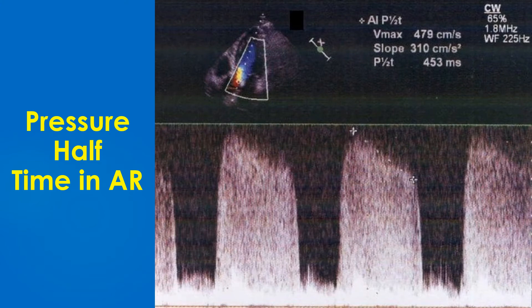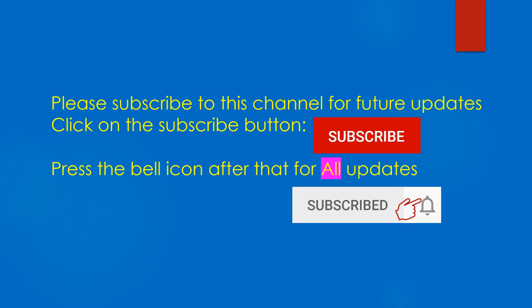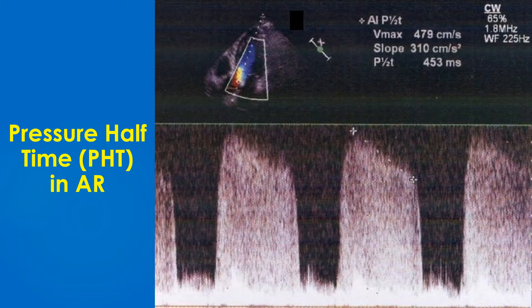The picture demonstrates measurement of pressure half time of the aortic regurgitation jet using continuous wave Doppler from the apical 5-chamber view. The apical 5-chamber view with colour Doppler is seen in the upper left corner of the image. The Doppler cursor is seen passing through the left ventricular outflow tract and aorta, with the aortic regurgitation jet seen as the positive tracing above the baseline.